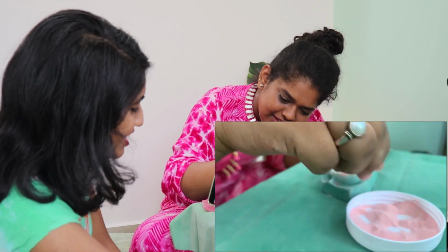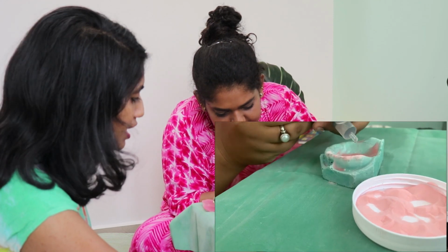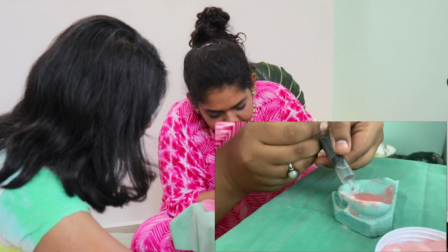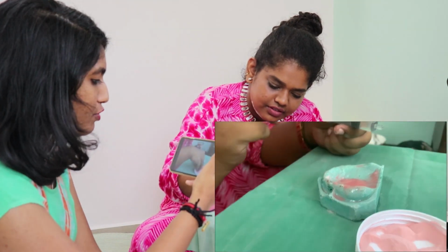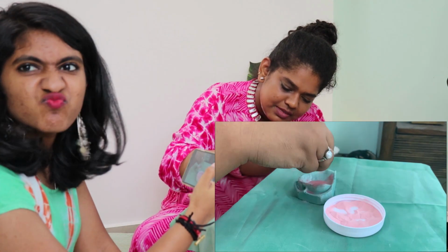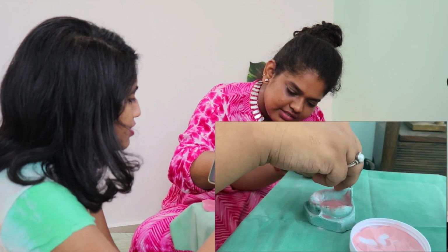How do I do it? You can't fully avoid it. One trick you can do is put the liquid first and then try the powder. That part is difficult. That is where the porosity keeps coming over and over again. It keeps sliding down. How do I get it into the crevices? It's hard.